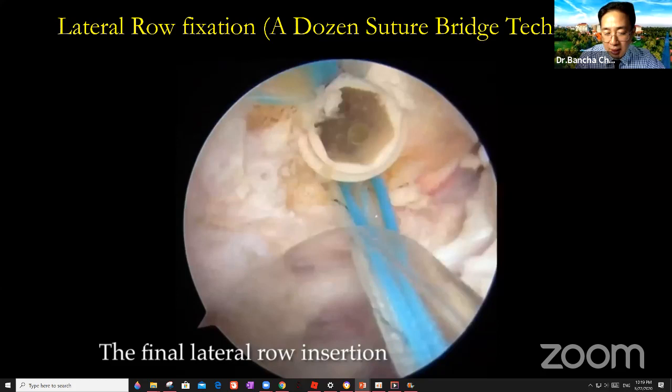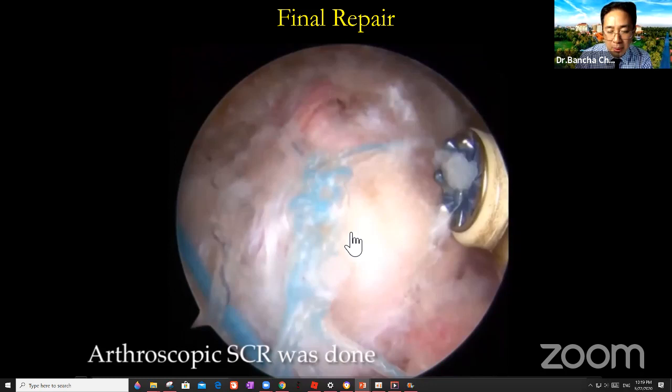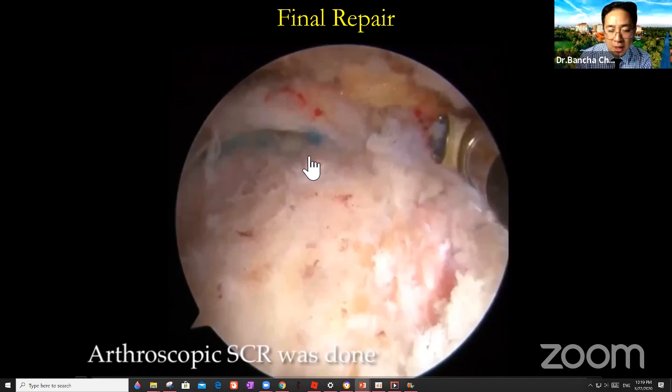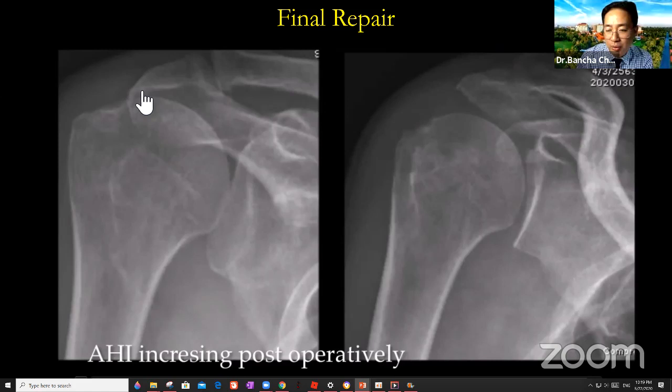So this is the final repair. Okay, you will have these 12 sutures because we want pressure distribution to the footprint, right? Okay, and on the medial side, you have repair to the glenoid, also repair to the rest of the cuff. This is the pre-op x-ray. You see that the AHI is very narrow, and post-op x-ray, AHI is getting better, okay?